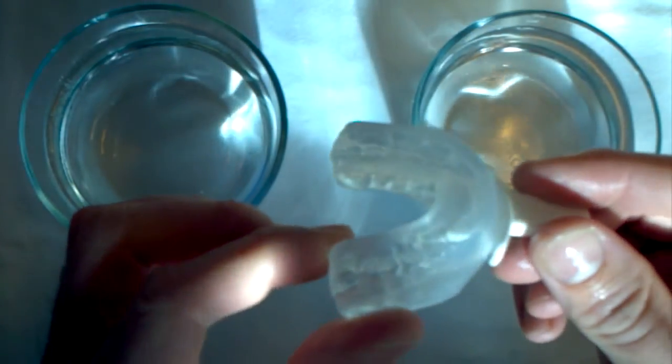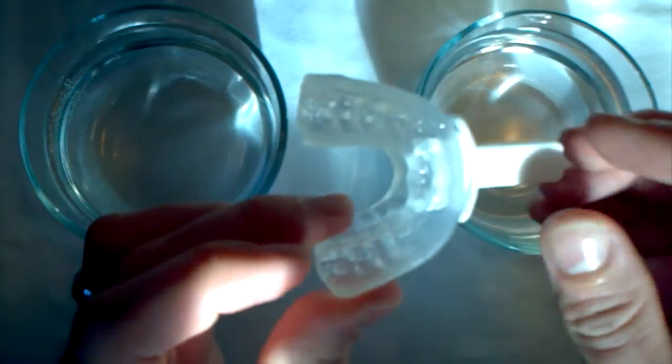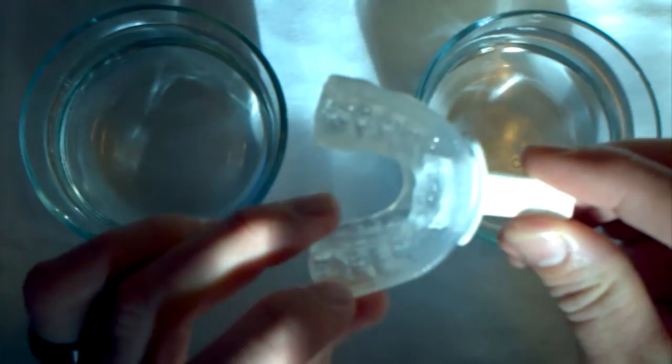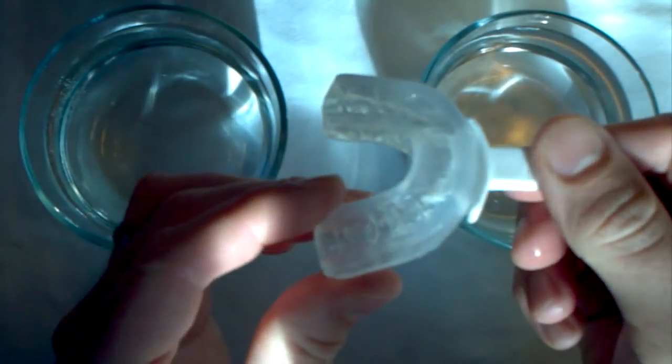I feel as though I got a pretty good impression. I could really feel my teeth sinking down into the plastic whenever I was doing this. And as you can see here, I did, in fact, get a good impression. You can see all of my teeth here. Each and every one of them, you can actually see an impression of each one. So I think I did pretty good.